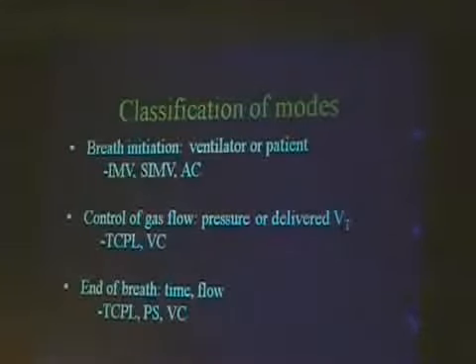delivering a volume, and it's not delivering a pressure. The ventilator has to do a lot more things when it does that, because you have to take into account the compliance of the tubing and the compression of the gas and the humidification and so forth. So we're still using predominantly pressure modes. The gas flow starts, you tell it to stop at a certain pressure, and then the gas flow stops or goes down. And what ends the breath?